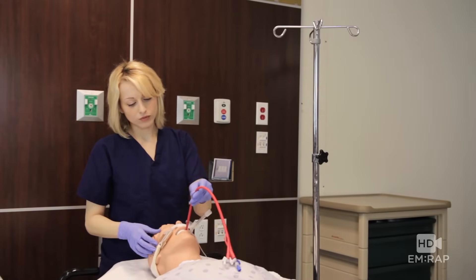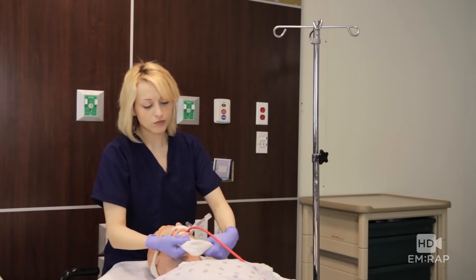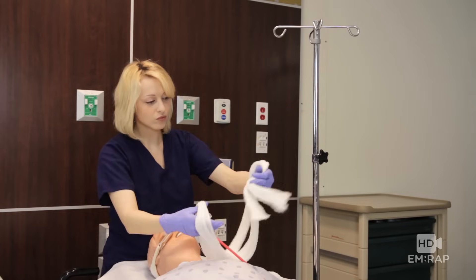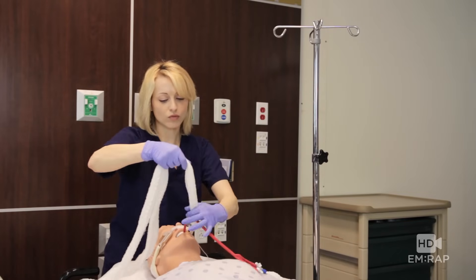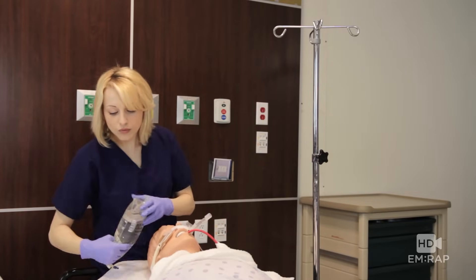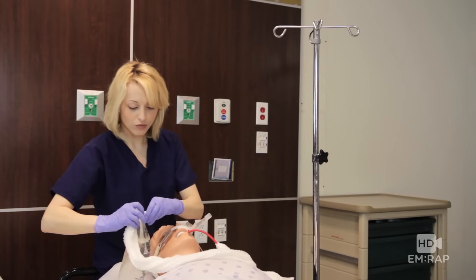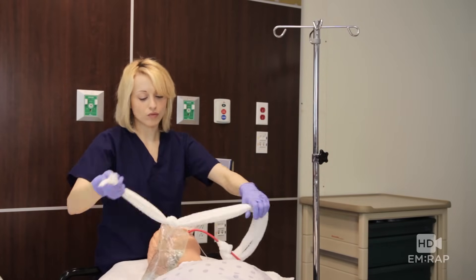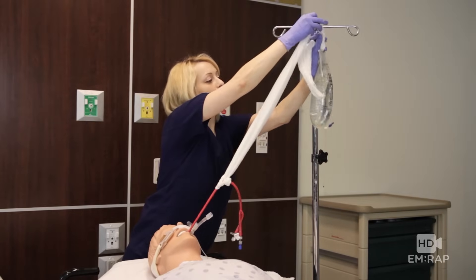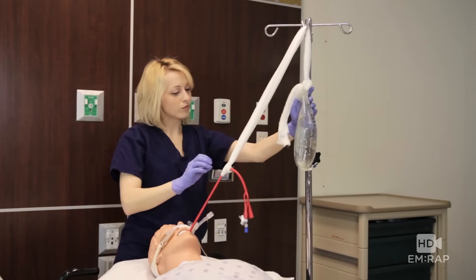Now we're going to set up traction using our liter bag of saline and Curlix. Tie a basic slip knot around your Blakemore tube on this end, then with the free ends grab your liter bag of saline, push those free ends through the hole on the top of the bag, and tie a regular knot. Hang this up over an IV pole — this pulls one kilogram of traction. No football helmet required.